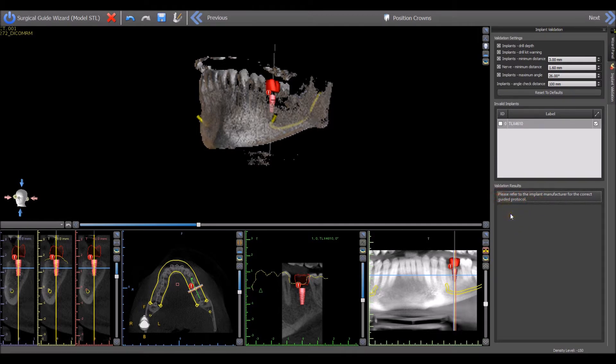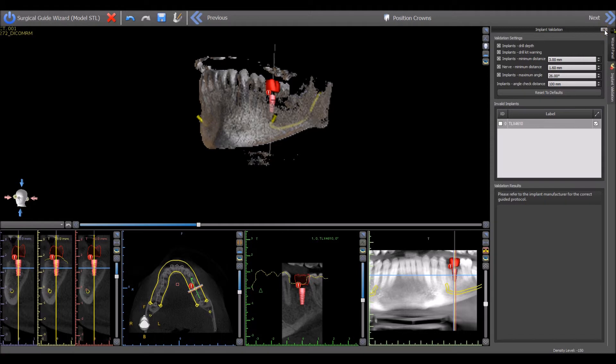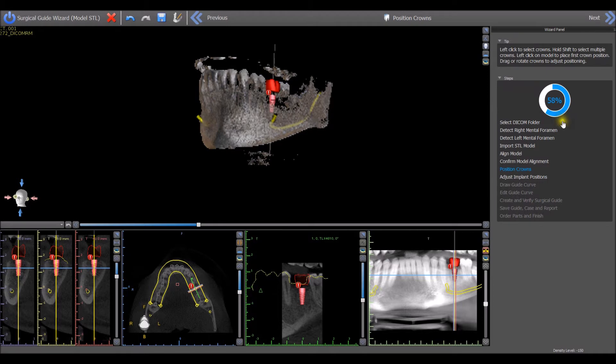will be displayed. The validation panel can then be closed by clicking on the X in the top right corner of the validation panel and the user can continue with the wizard process flow.